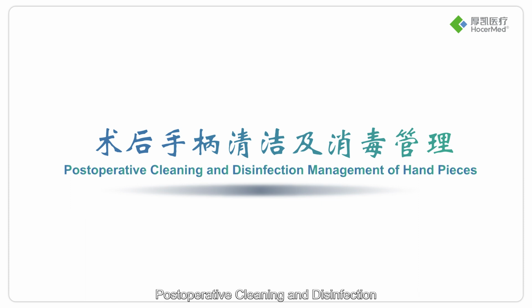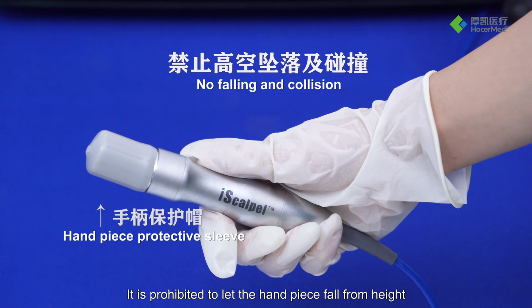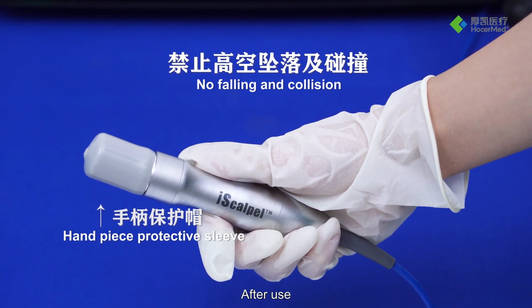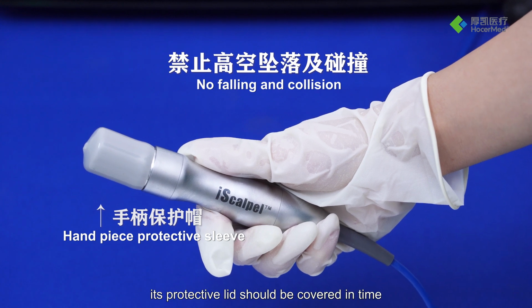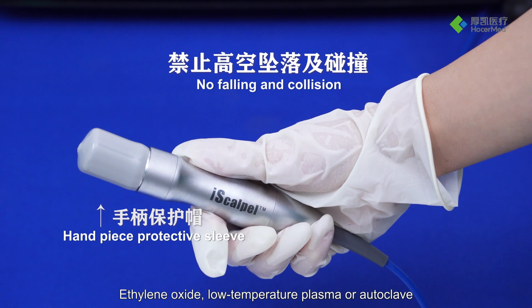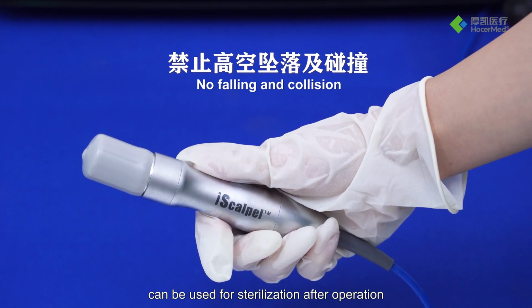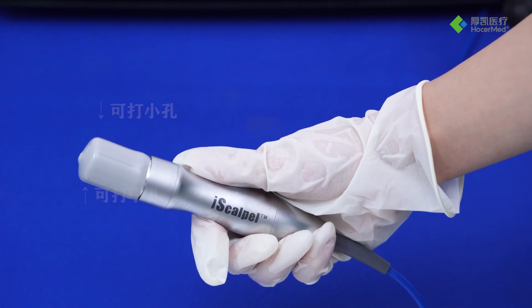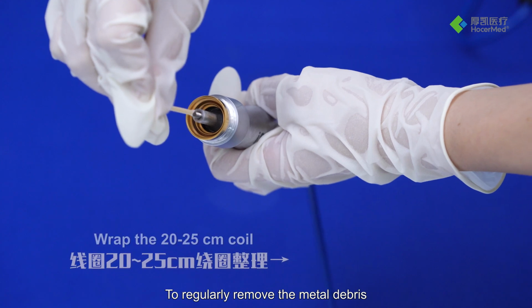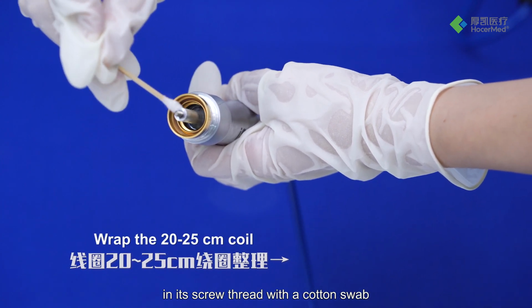Post-operative cleaning and disinfection. It is prohibited to let the handpiece fall from height or be collided in operation. After use, its protective lid should be covered in time. Ethylene oxide, low-temperature plasma or autoclave can be used for sterilization after operation. 2 holes can be cut on the protective lid to regularly remove the metal debris in its screw thread with a cotton swab.